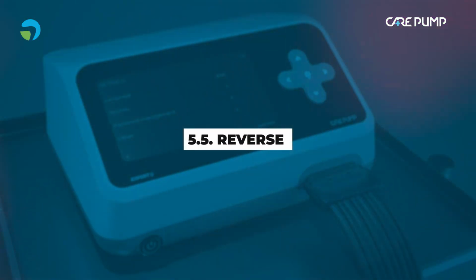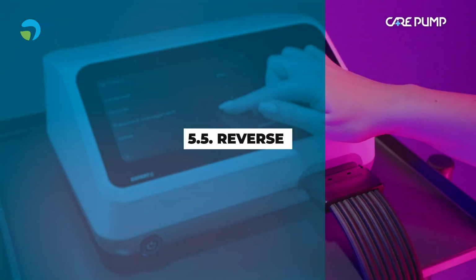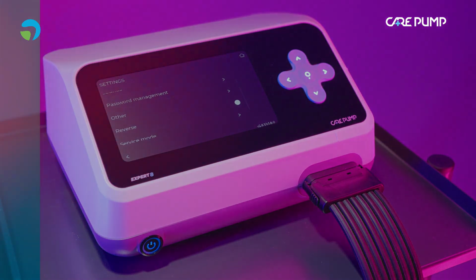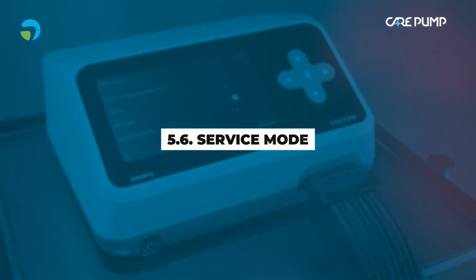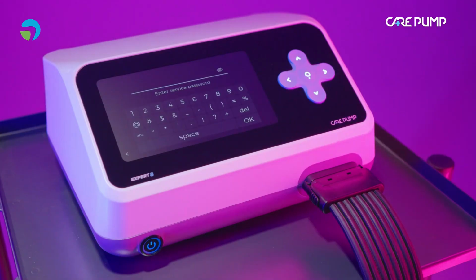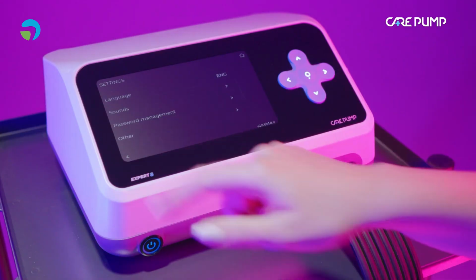Reverse mode. Reverse mode allows setting the inflating of the chambers in the opposite direction, from the last chamber to the first one. When this option is activated, any selected work mode will inflate in the distal direction. Service mode. Service mode is an option protected with a password, available only for the authorized service personnel.